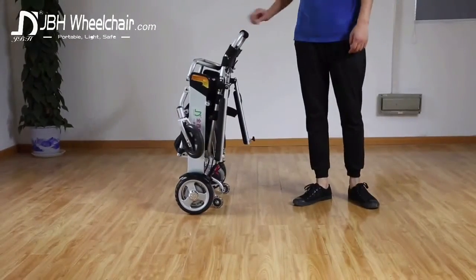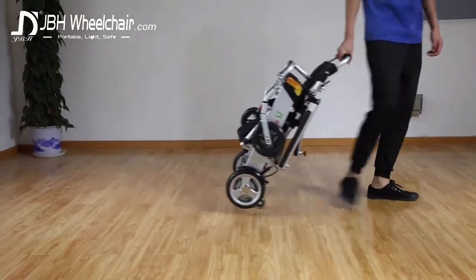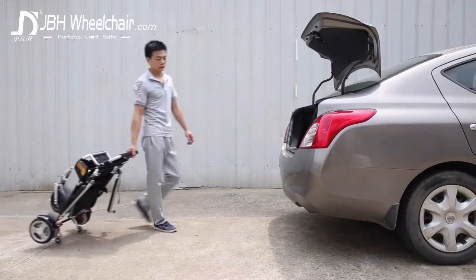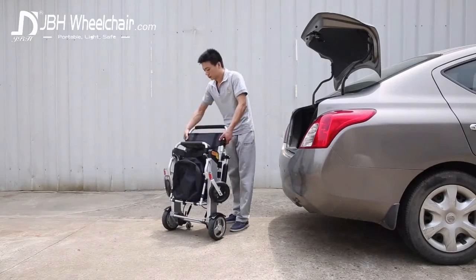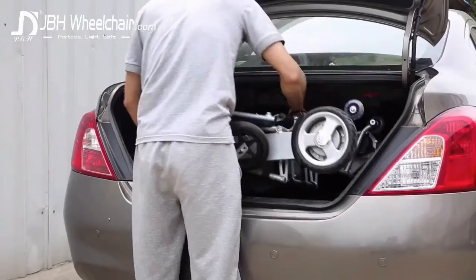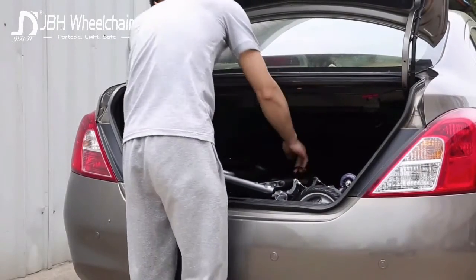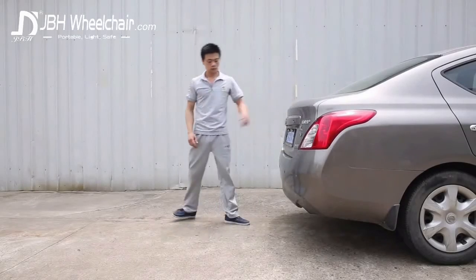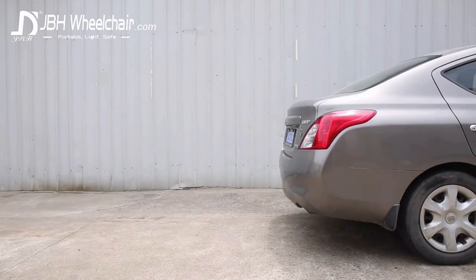No bigger than a suitcase and so light, thanks to the aluminum frame. This chair weighs just 51 pounds including the battery, but can support a weight of up to 165 pounds and travel at nearly 4 miles per hour. The D05 fits easily into the trunk of a car, so you can travel further afield in comfort and in ease.